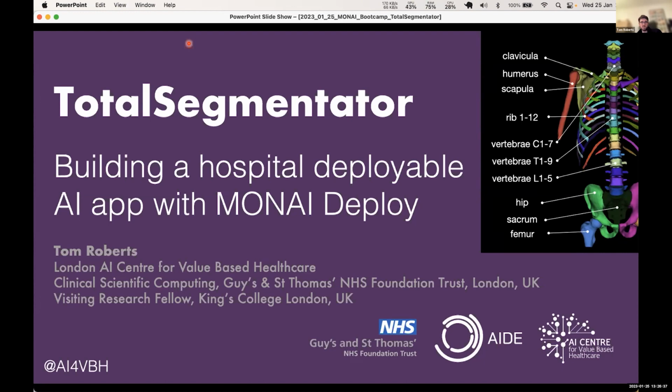Yeah, good question. So at the moment, it's just segmenting the regions that I've shown you. There are some subtasks, and I hinted at that one, which was looking at hemorrhaging, but to my knowledge at the moment, I don't think there's one specifically for tumors. But again, what you could do is potentially retrain it. If you've got labeled tumor data, say, lung nodule data or something like that, they've provided the networks, you could retrain it and potentially get those segmentations out.